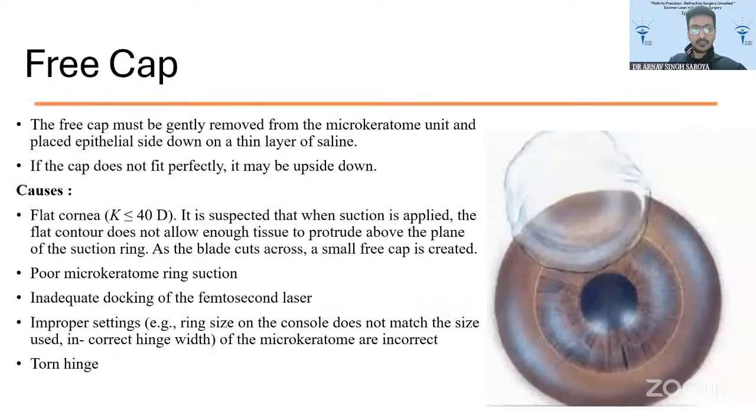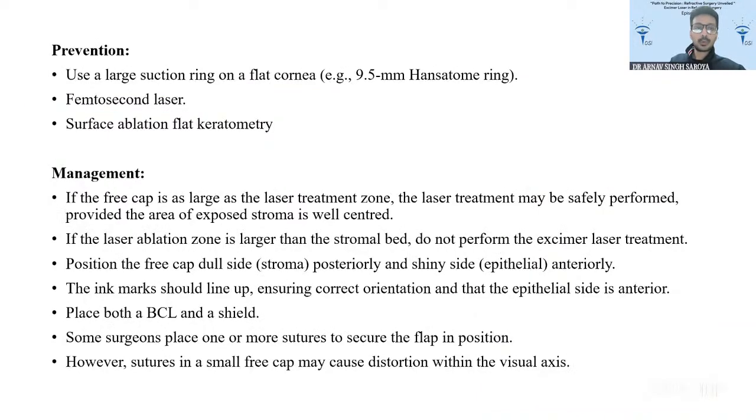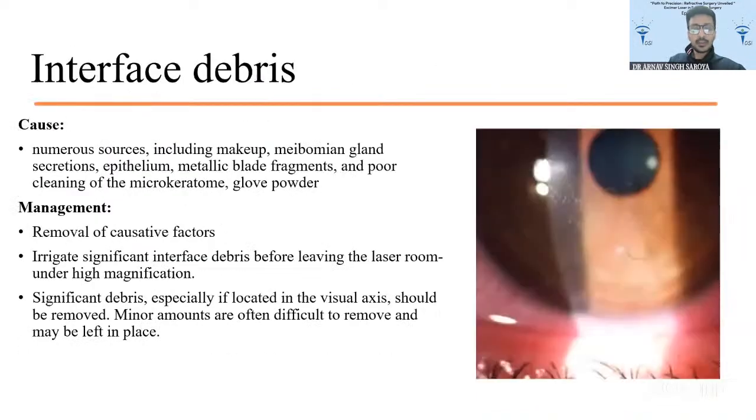Then you have free cap. The free cap must be gently removed from the microkeratome unit and placed epithelial side down on a thin layer of saline. And if the cap does not fit perfectly, it may be even put upside down. Then you have very commonly interface debris.